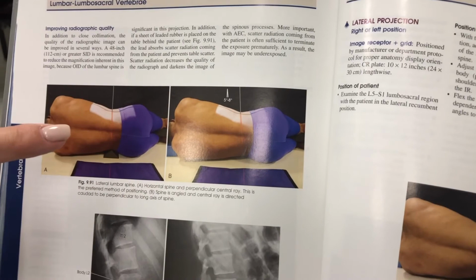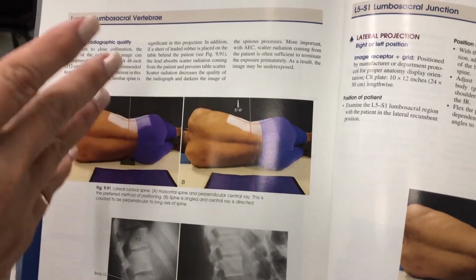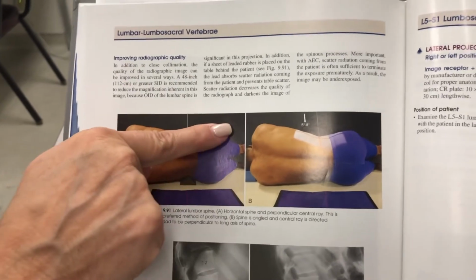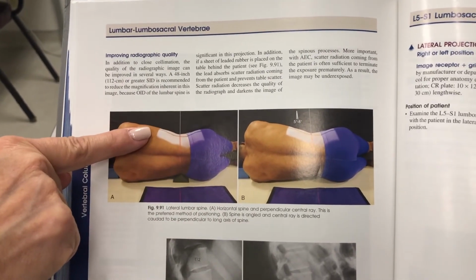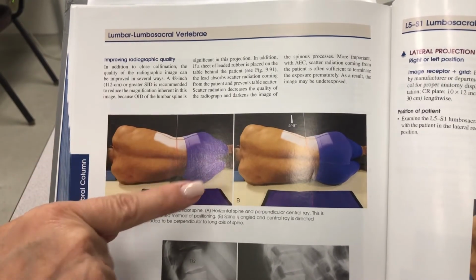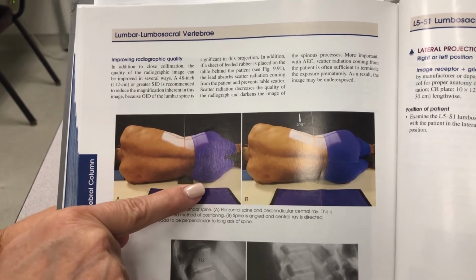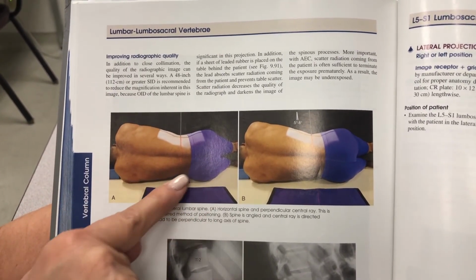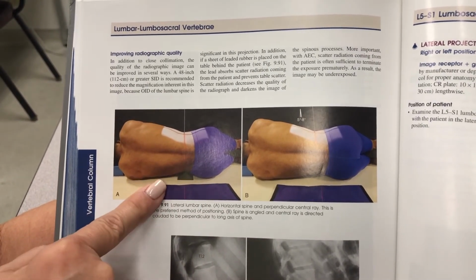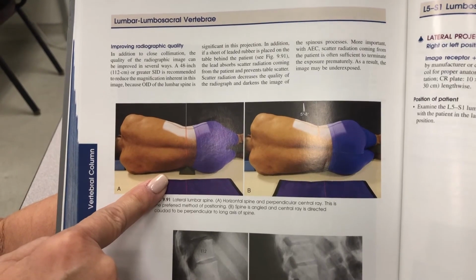My patient body habitus, he's pretty straight from the bottom of his scapula to his hips. And so because he doesn't dent in right here like the patient in the book, I didn't feel that I needed to do a caudal angulation.